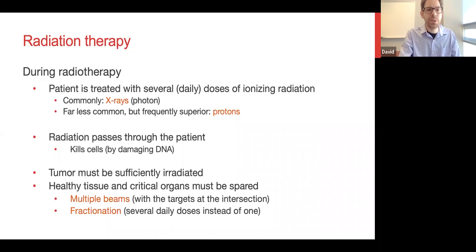And most commonly we use photons, so X-rays, to irradiate the patient. But there are some other options too. These are far less common, much more expensive, but are frequently superior, such as proton therapy. I'll talk a little bit about these later on, because one of the projects, actually both of the projects to some degree, are related to this question of should we use photons or protons, or how can we use them, and what the differences are for different patients.